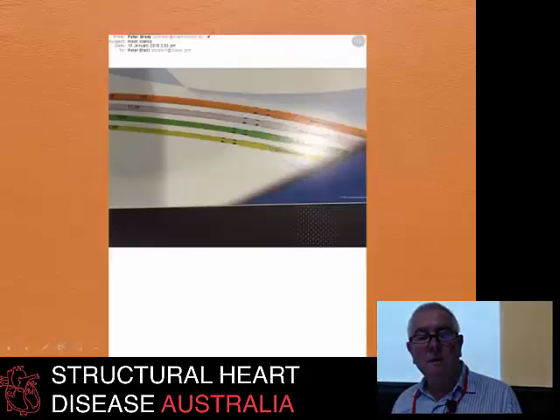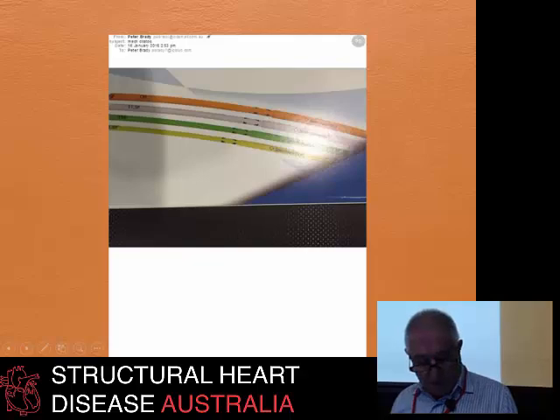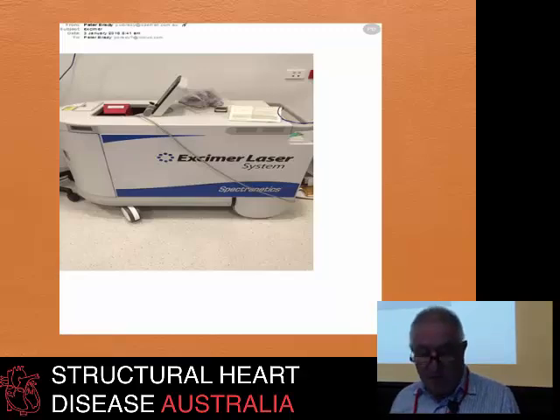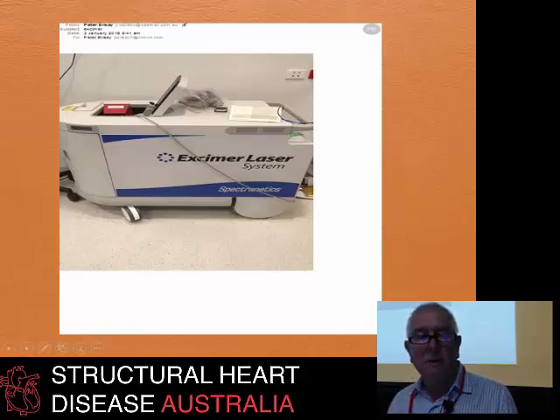These are the mechanical dilator or dissecting sheaths that are available. There's a range of sizes, and this is basically the standard gear that we would use, and then move on to using a laser if we're not having any success with the mechanical dissectors. And I use a laser in about 30% of the cases. Other people are much more liberal with their use, but using the laser has also been demonstrated to have a higher incidence of perforation. So I think it's wise to be somewhat sparing in the use of the laser.